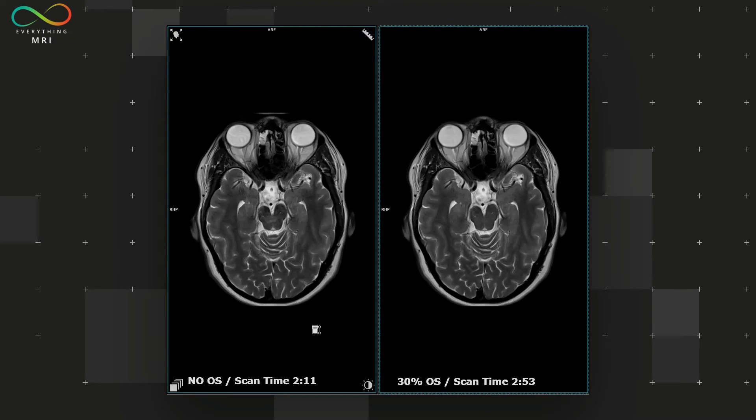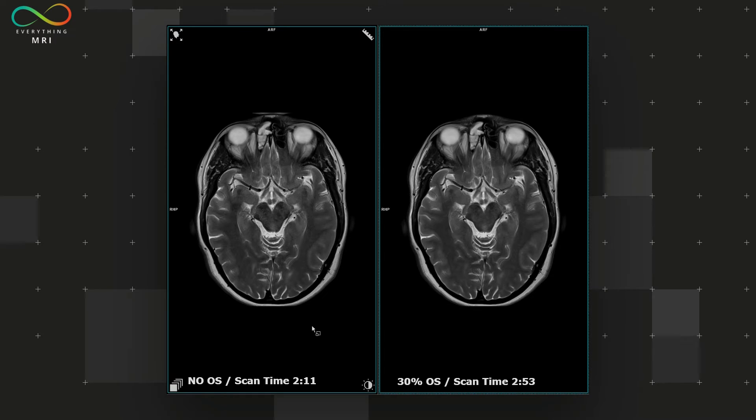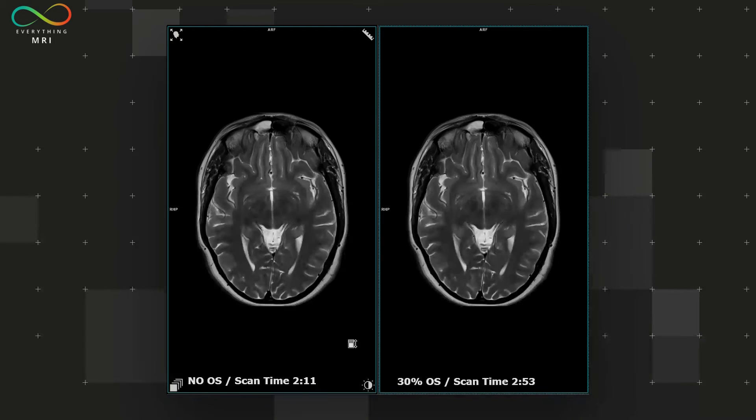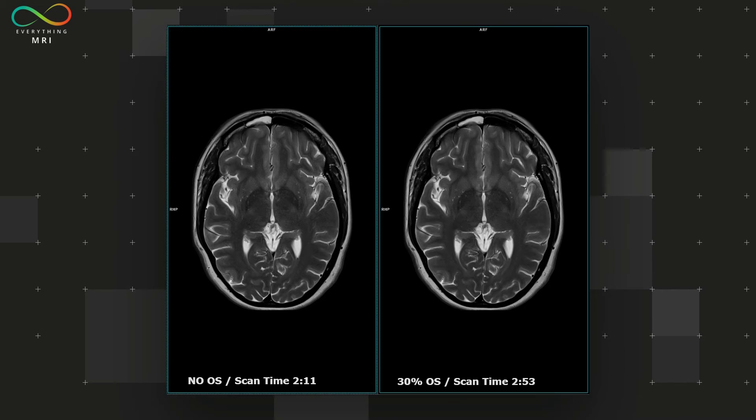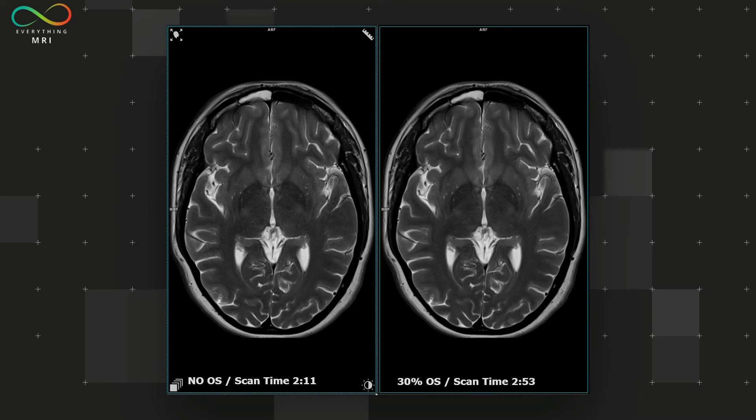You can see that there is the beautiful nose of our healthy volunteer which extends beyond the FOV. Luckily, still outside the brain parenchyma with no significant consequences. You might also notice the posterior part of the head wrapping anteriorly for the same reason. While not a major issue from a reporting standpoint, it's certainly not ideal for achieving top-notch image quality.